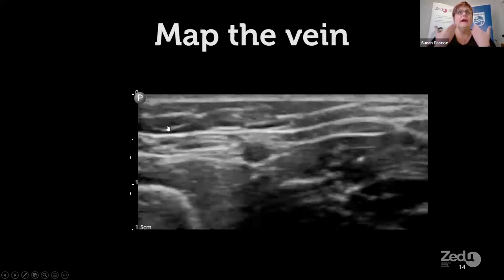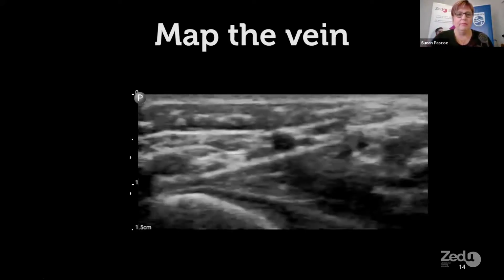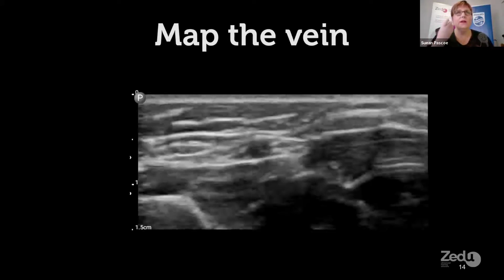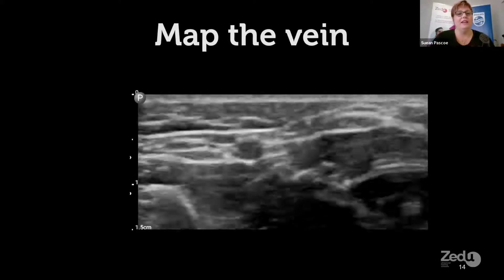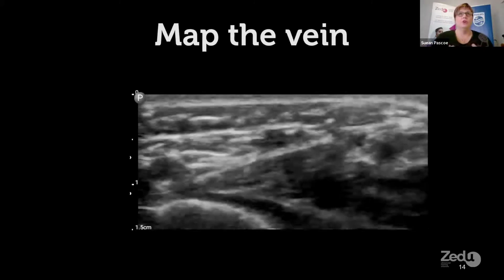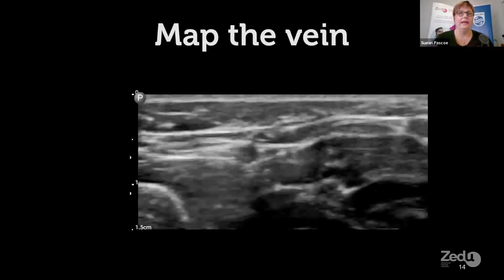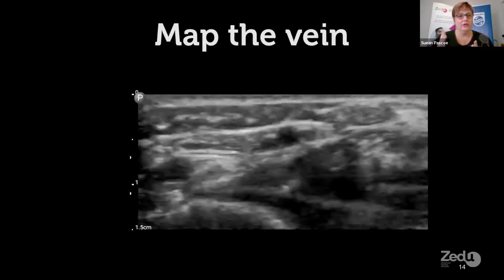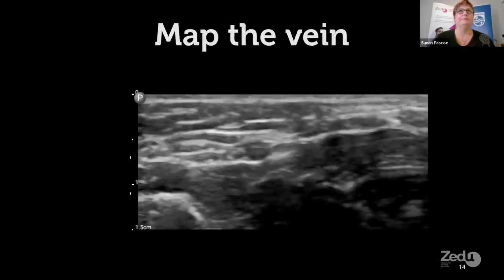Like the jugular vein, doing that technique blind, you want to aim a little bit medially, but sometimes those vessels can sit quite straight, or as you track up and down the vein, you find some clot or something. So it's a good idea, once you've chosen your target, to track it up and down the arm or the leg, the neck, to follow the path so that you know that it's lying straight, and you've got a good idea in your mind where this vessel actually goes.